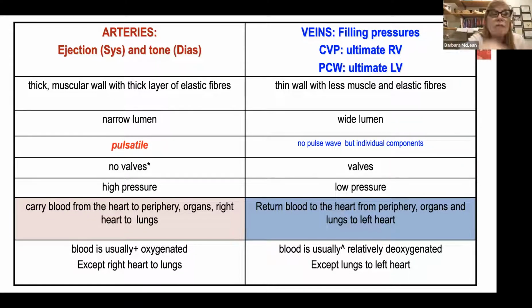because remember, you're looking towards the atria. You're not in the ventricle. You may not even be in the atria. You're looking towards the atria. So what you're going to see are small pressure fluctuations that tell you about three basic things that happen. The atria contracts, the valve between the atrium and ventricle closes, and when the ventricle is ejecting, the valve bulges upwards.